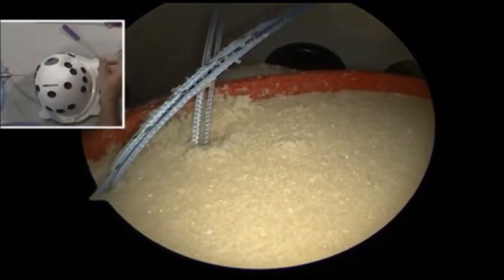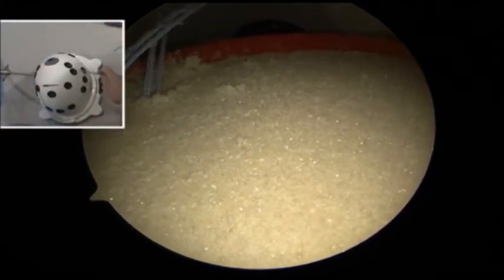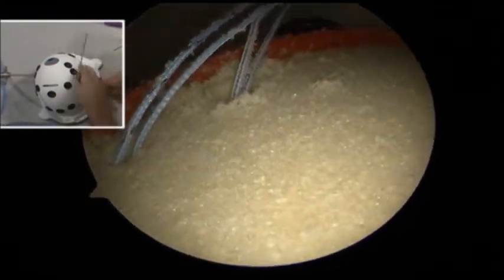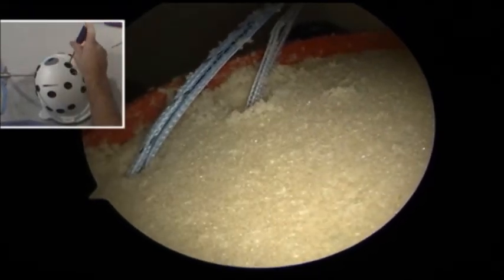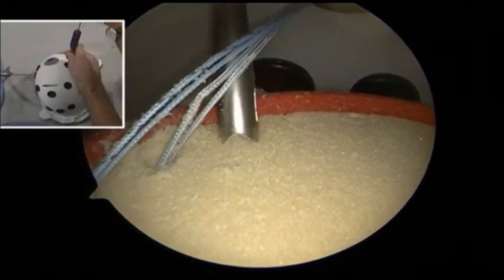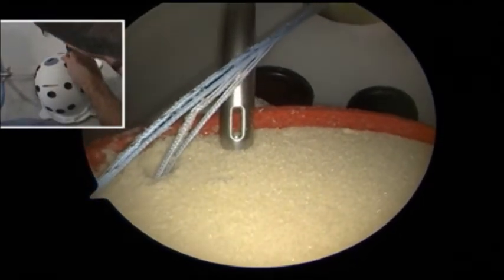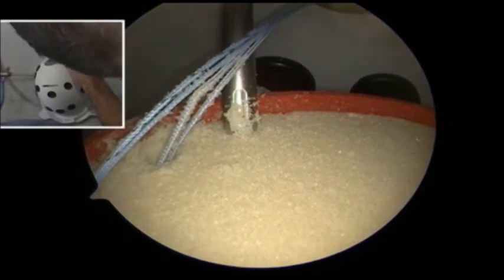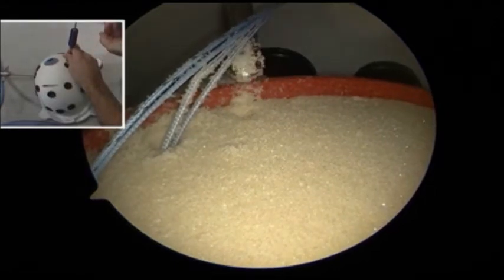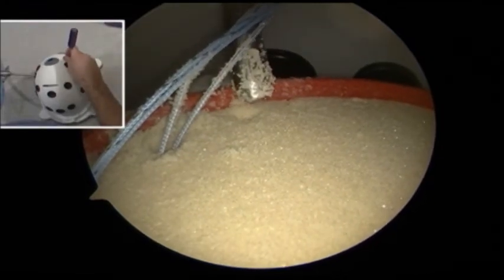And with the last one, we're going to demonstrate one more time an example of what not to do. I'm going to retrieve these out of our suture saving cannula. Placing this onto our glenoid margin. He's going to allow the drill to stop, and as he pulls back, it will pull my drill guide up off of the bone.